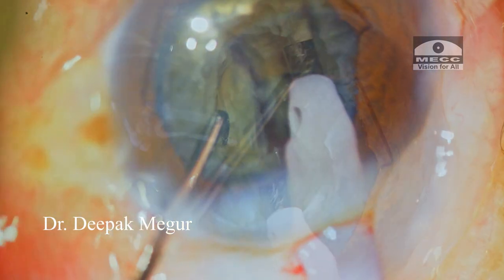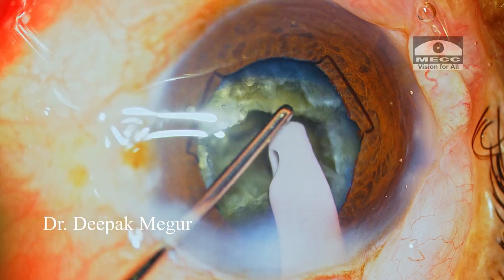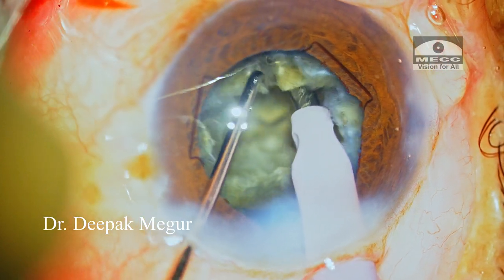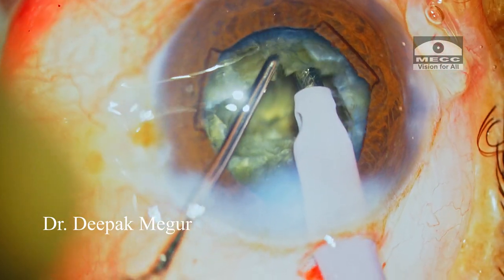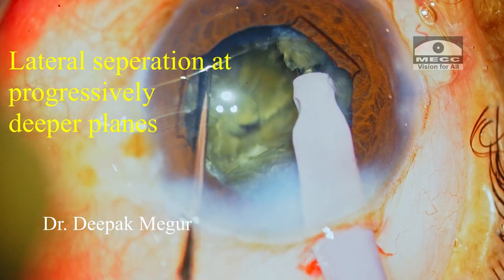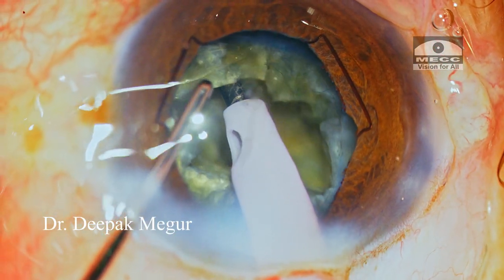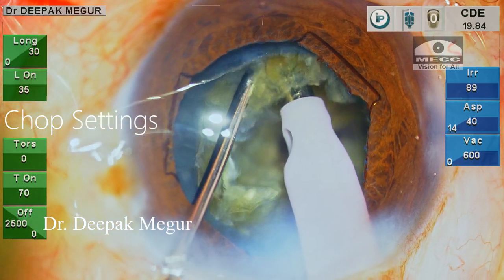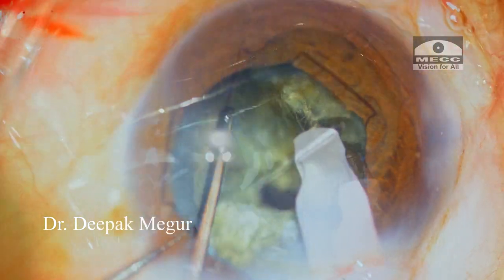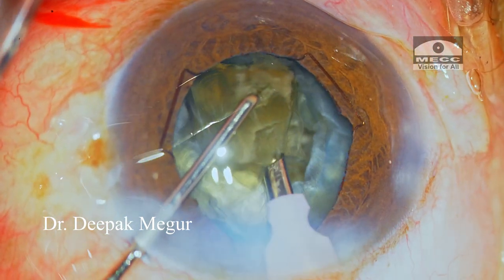Once the two hemi-nuclei are created, I begin vertical chopping of one of them. As the nucleus is hard, after chopping it's important to perform lateral separation at progressively deeper planes so we can divide the fragments successfully without inducing stress on the surrounding structures — the bag, posterior capsule, and zonules. Among the three fragments I now have, I emulsify two and plan to retain one fragment in the bag as a tamponade, keeping the bag from becoming very floppy.